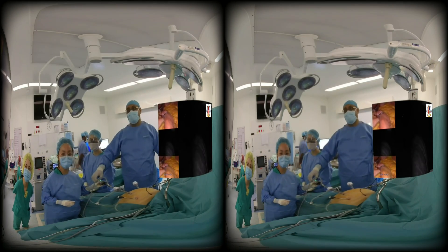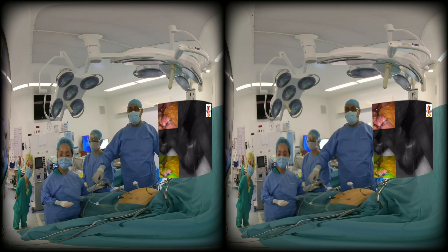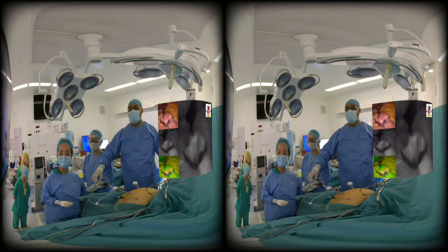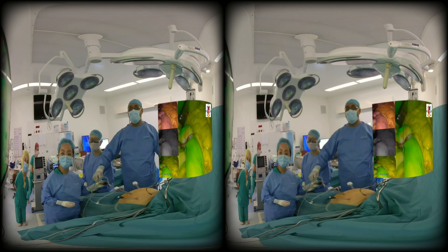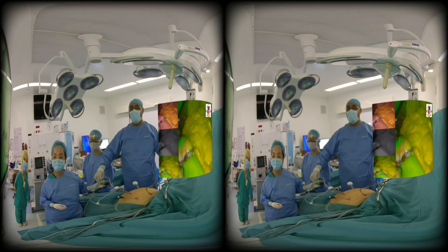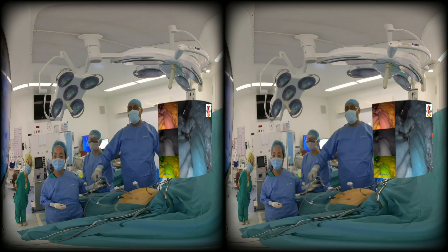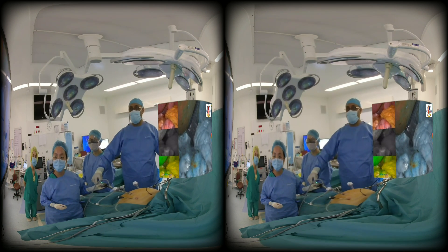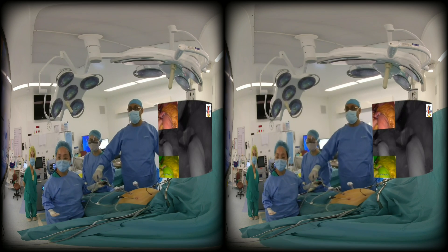We check our anastomosis for viability using the NovaDaq system. ICG contrast has been given. You can see the changes in the gastric pouch and jejunum — the gastric pouch is slightly delayed compared to the jejunum but becomes really bright. The ICG shows vessels being highlighted very well and the liver is quite profusely vascularized. Those little areas near the anastomosis need not be a concern. The maximum concentration of dye is in the artery supplying the gastric pouch — a very well-vascularized pouch and a well-vascularized jejunum loop.